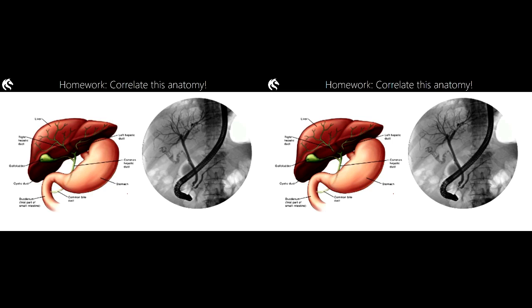Now, the image on the right hand side of the screen is an ERCP image. In fact, if you were to do a Google Images search for ERCPs, you'll probably find this image fairly readily. Look for it online or steal it out of your notes. This projection in front of you here is exquisite. It is beautiful. If you could take this image and correlate all of those contrast-enhanced tubes with what anatomy they are feeding into, you will have a fantastic knowledge base of hepatobiliary anatomy.